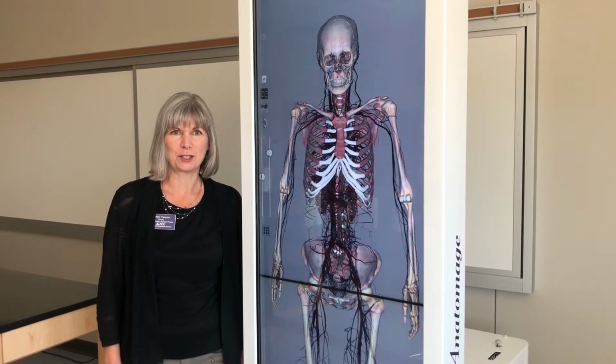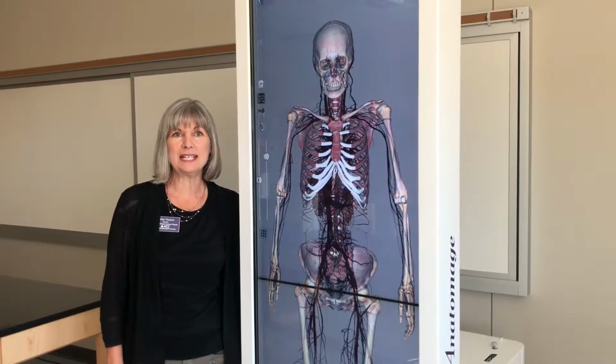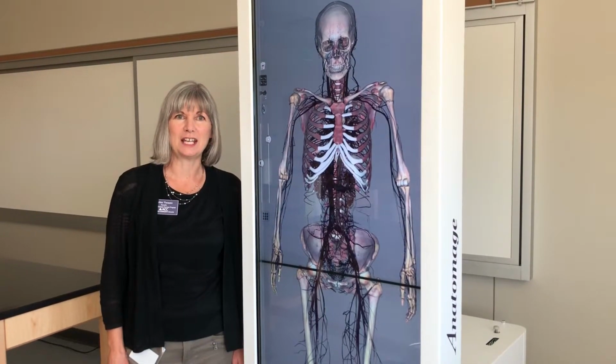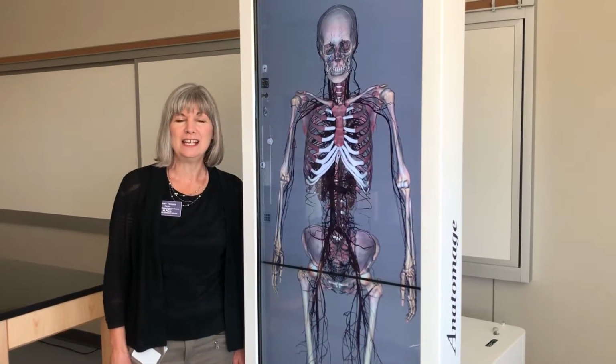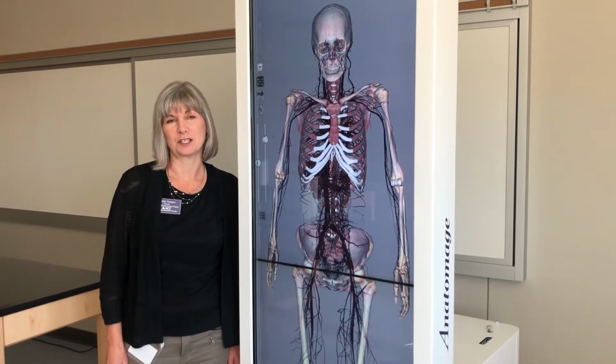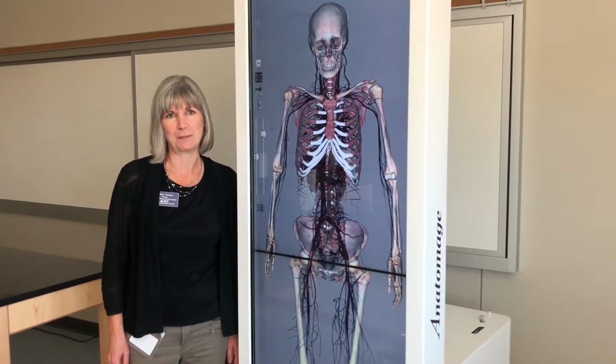This is the Anatomage Table. It's our virtual dissection table and contains 3D images of human bodies. This table is used in Anatomy and Physiology classes, the Physical Therapist Assistant Program, and the Nursing Assistant Program, as well as other classes offered at the Collaboration Campus.